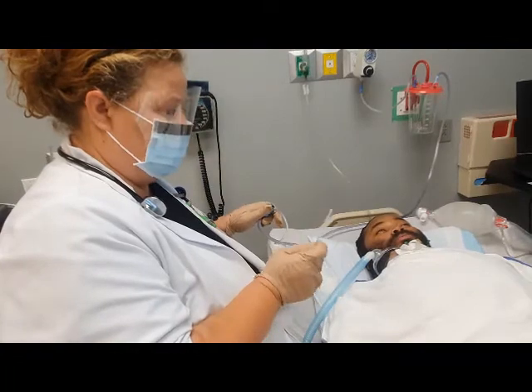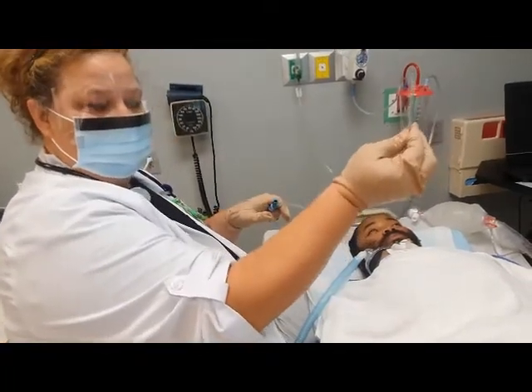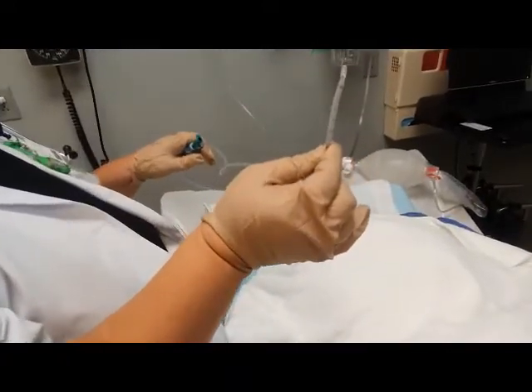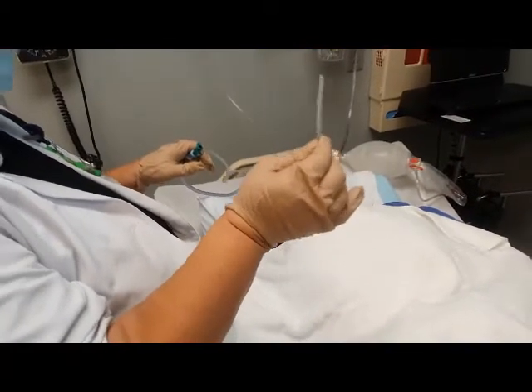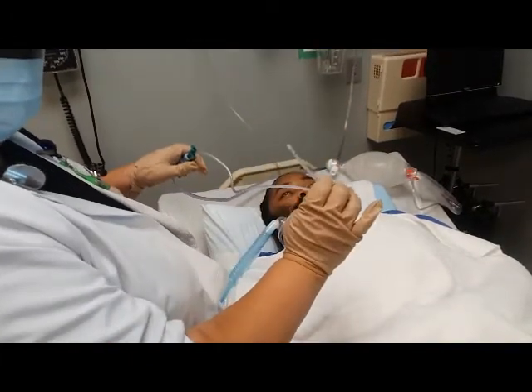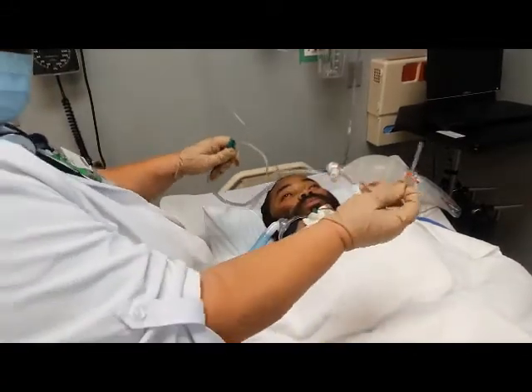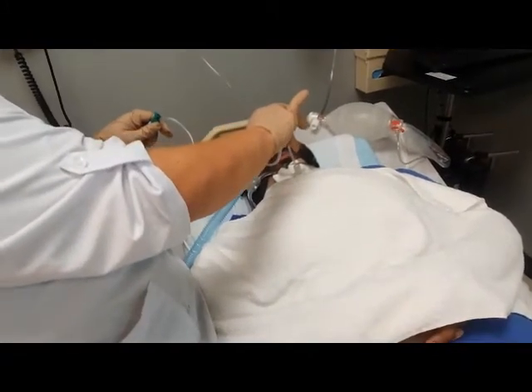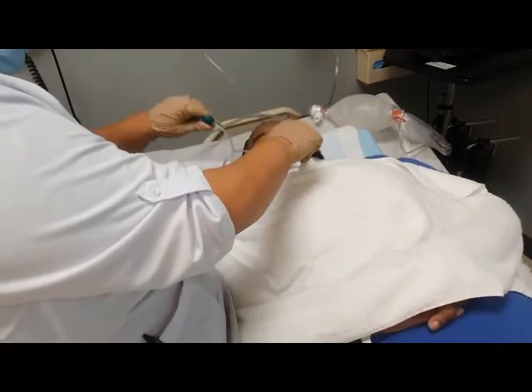So now that she's done bag mask, avoiding contamination, hold the suction catheter like a pencil and introduce it into the trach tube until the prescribed depth or resistance is met, about 6 inches. Okay. So the one thing to really watch with this is when you're inserting this as a pencil, you've got to make sure that you do not drop your wrist onto the patient's chest, because that is a contamination. So you take the pencil, you enter in. You do not apply suction as you insert the suction catheter.